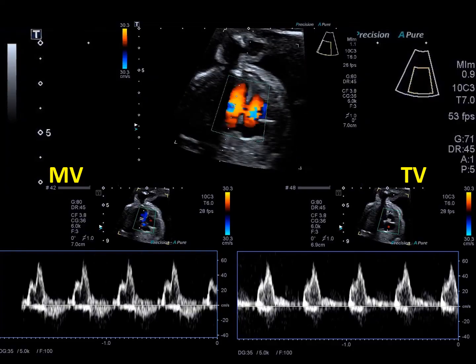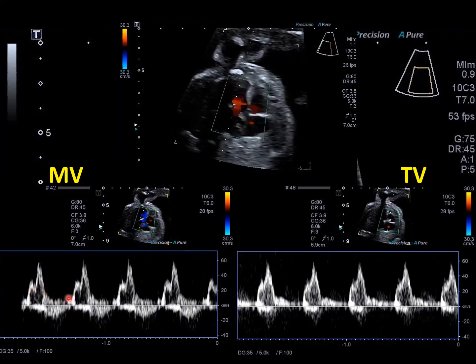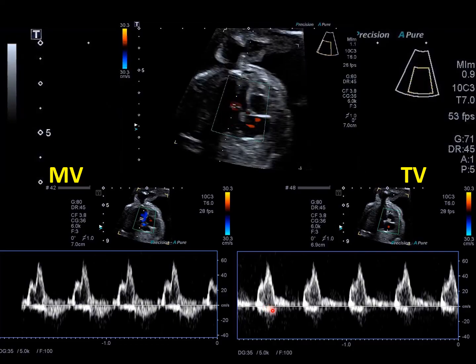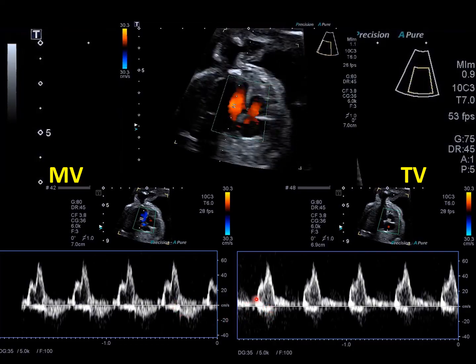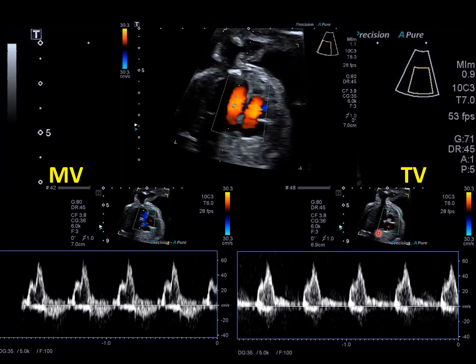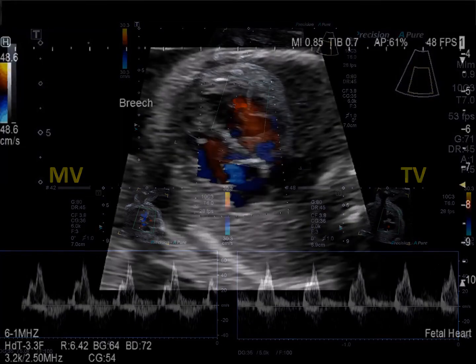The waveforms are more clear to see, and you can clearly see that the E wave and A wave are shown nicely. And of course, different factors contribute to whether you see a monophasic or biphasic mitral and or tricuspid valve inflow, but this is a great example of how you can line these things up and get more accurate information with proper alignment.